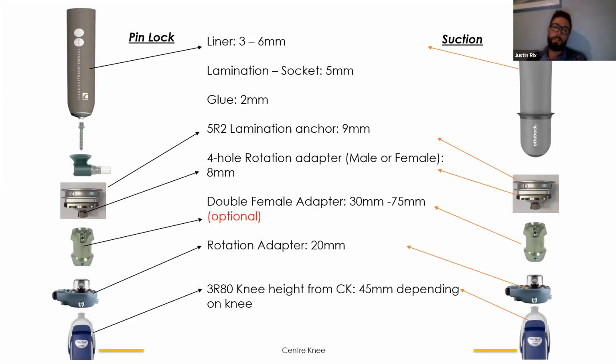There's other methods to suspend a prosthesis. These are just two of them. You can get skin suction, which is used a lot in the government for transfemoral amputees, where you have direct skin suction between the socket with an expulsion valve. So you pull the limb into the socket and a valve will then seal at the most distal end of it. And you can use socks, so you put a literal woolen sock over the residuum, and then you'd use either a PTB strap in the case of a below knee amputation, or a Silesian belt in a transfemoral amputation.